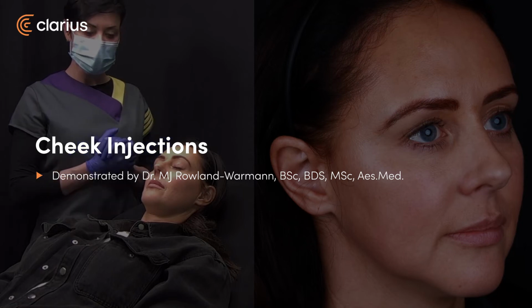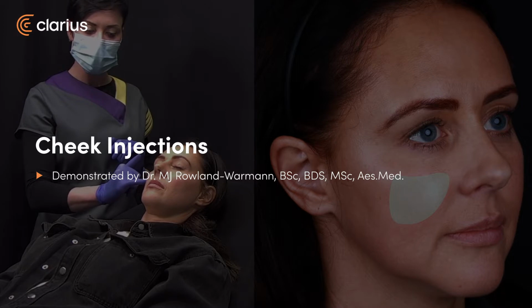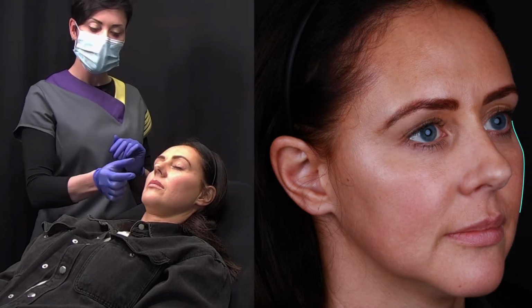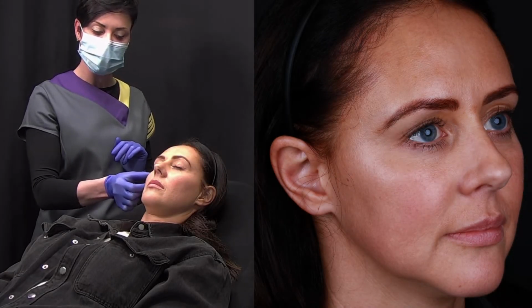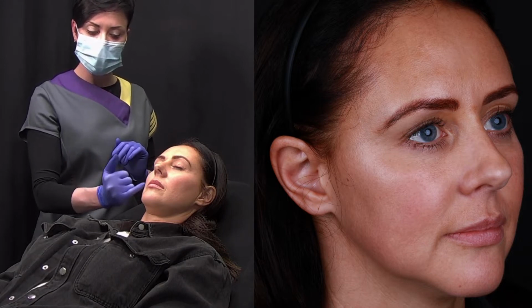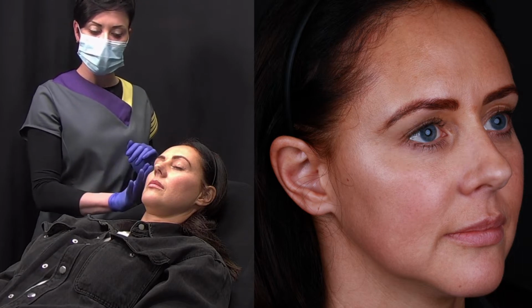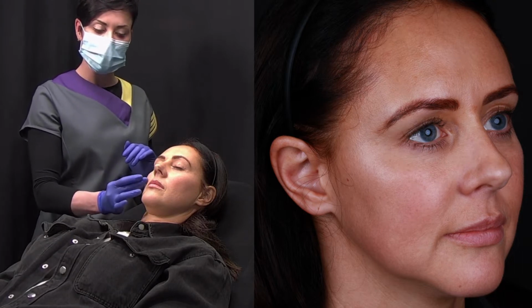My preference is to start with the cheek and treat into the deep fat compartments to restore the cheek volume. This will improve the ogee curve and lend support to give a more feminine contour. This acts as an ideal precursor to treating the tear trough, as the added cheek support allows subsequent filler underneath the eye to be placed sparingly and blend nicely to the midface.